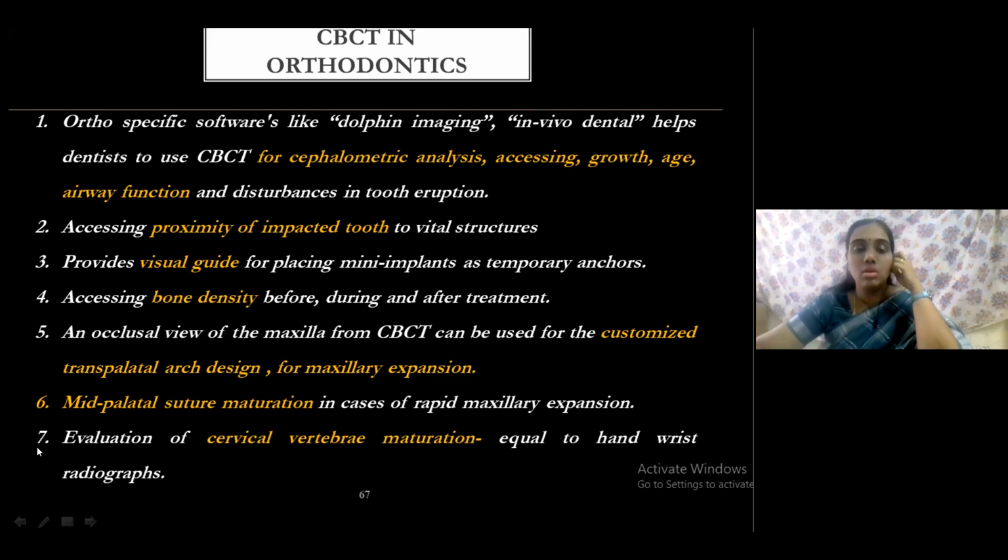The advantage of taking CBCT in orthodontics is that as an orthodontist you would take a lateral cephalometric radiograph, you have to take an OPG, and then you have to take an occlusal view in case you're going for an arch expansion. So all these radiographs are combined into one in the case of CBCT.